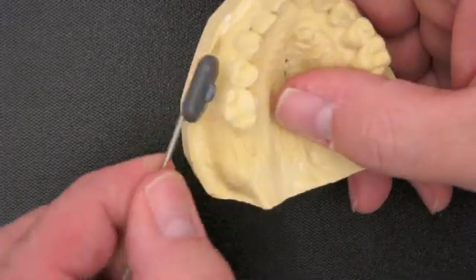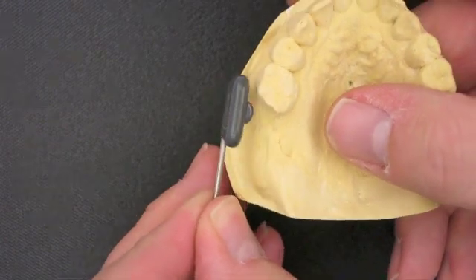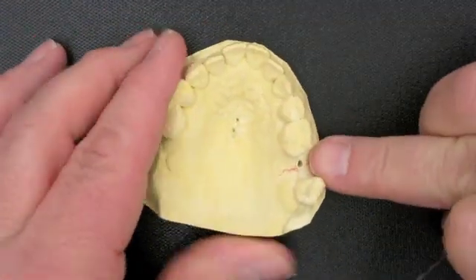On this patient, this doc had a question of implants versus bridges. And we can always move that actuator forward. It may interfere with speech a little bit. Patients need to be.